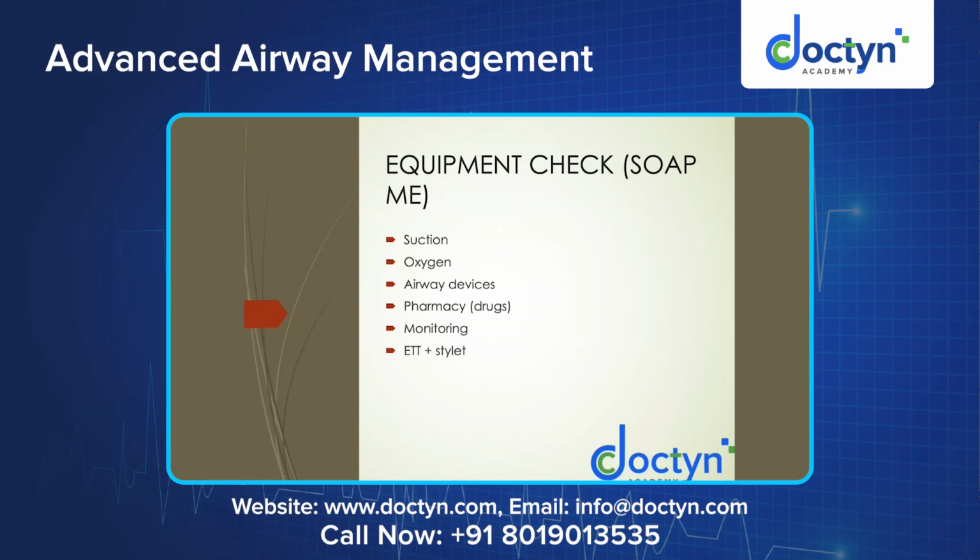Second thing is oxygen. Oxygen supply is anyway important. You are doing ambu already. And sometimes you also check that the ventilator is connected, because once you intubate, you ventilate the patient through a ventilator. So whether the ventilator has the proper oxygen supply, or is connected to the oxygen supply or not, is what you always have to check. And airway devices, as we said, when the intubation has failed, you always have to check whether there is an oropharyngeal airway and a supraglottic airway to rescue your ventilation.